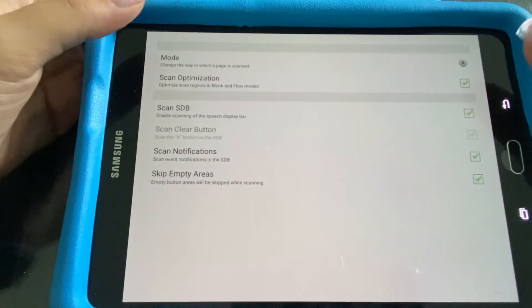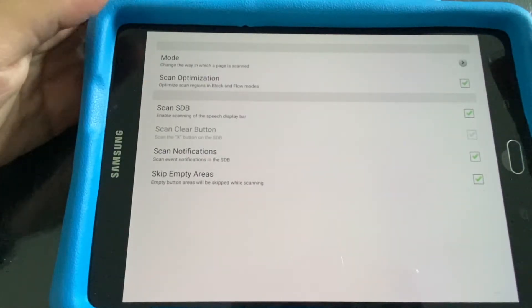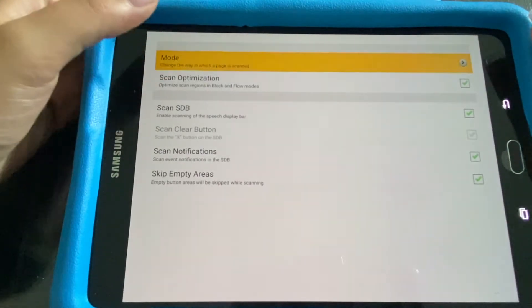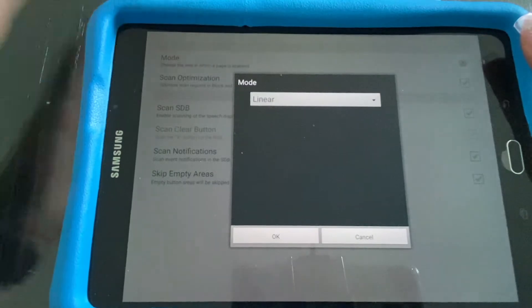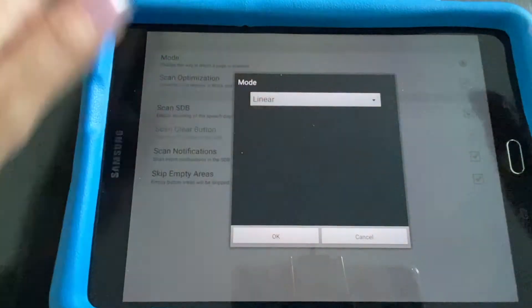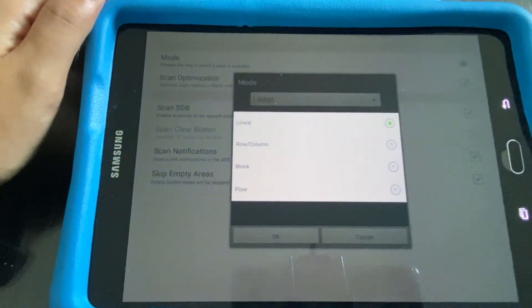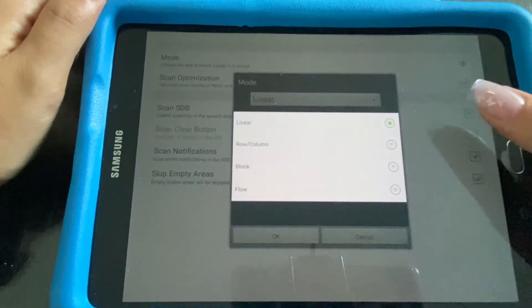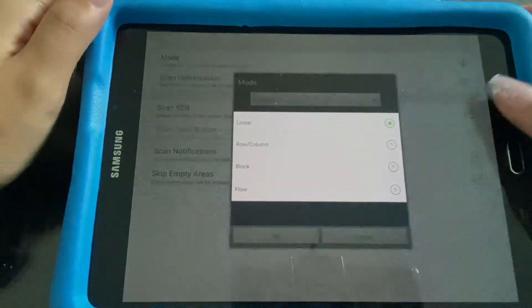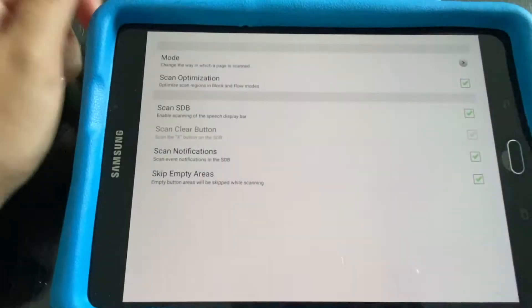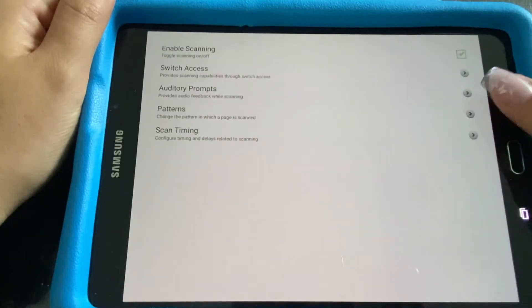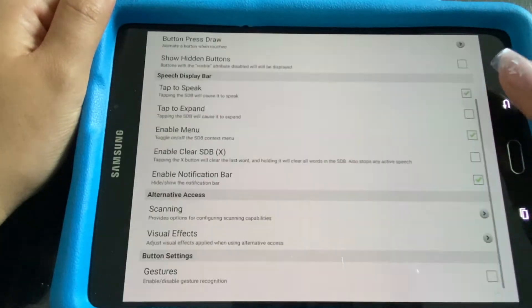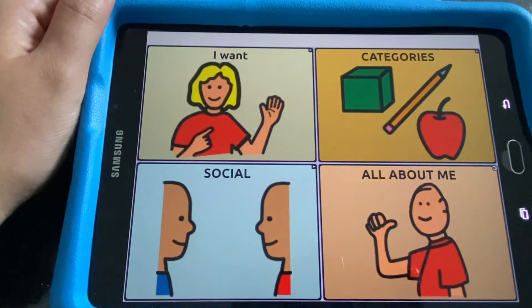Here you will also be able to change the mode of the prompting, so if you want it linear, by rows or columns, blocks or flow. Once all that is done you want to go ahead and come out.